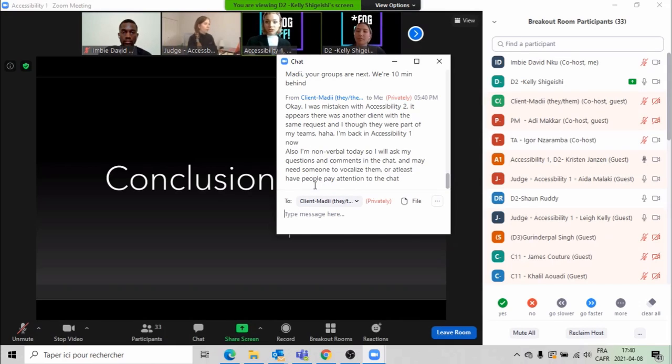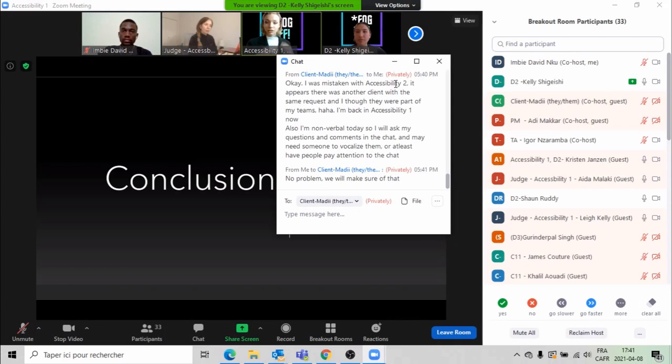We would include with the packaging a little protective film if this were to be marketed, just to keep dust off when you're not using it. But overall, the medical grade silicone that we were using for creation has been tested to withstand approximately 200 wears. And then you would ideally replace it. So we would potentially sell just the bottom piece, for a lot cheaper than our entire product.